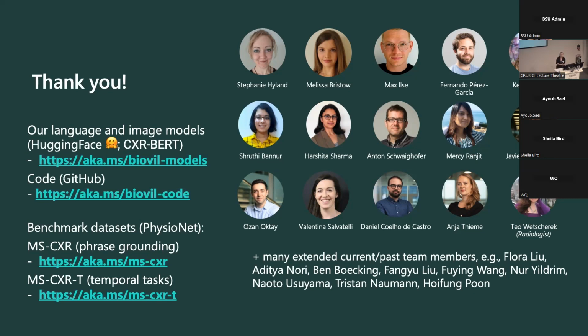We're not explicitly feeding this information to the model. I think with AP versus PA, you can kind of tell just by looking at it. But yes, this would potentially be a source, especially if there's some alignment, and we do find this: patients who are sicker are more likely to have an AP scan. So there might be some association that our model picks up on between some basically spurious feature and the fact that they have all of these other findings. So yes, it's definitely a concern. We haven't characterized the extent to which it's impacting our results though.